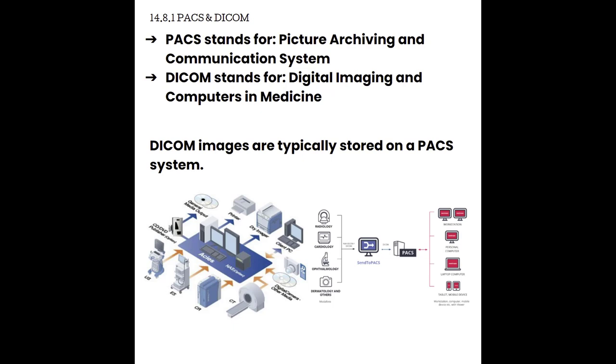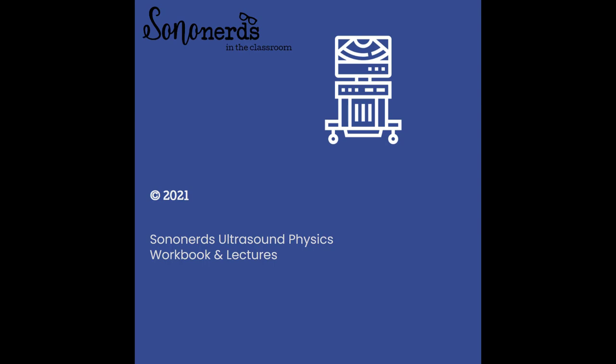And so this is where I was saying you want to be careful about exporting in a DICOM format versus exporting in a personal computer format. Most people's personal computers cannot view DICOM images. And that is the end. We made it all the way from beamformer to storage. We now know how our machines handle all that data, transform it into something we can see, and something that we can review later in our PACS system.